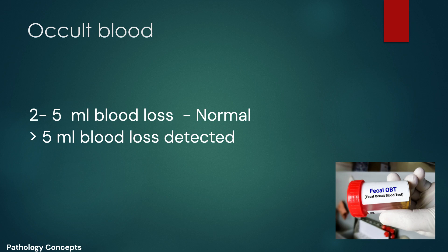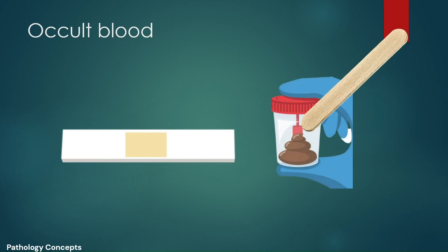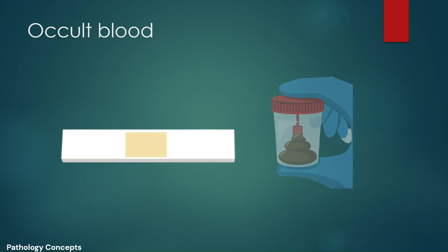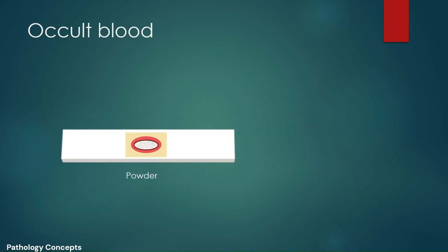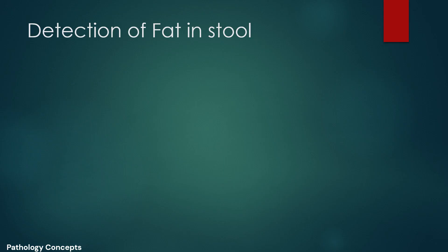Let's learn the procedure of the occult blood test. First, take the slide and place a filter paper on it. From a wooden stick, take the stool sample on the filter paper. Now add the powder provided by the kit, then add H2O2, and observe for reaction. If blue color is observed after 2 to 3 minutes, the test is positive and occult blood is present in the stool.